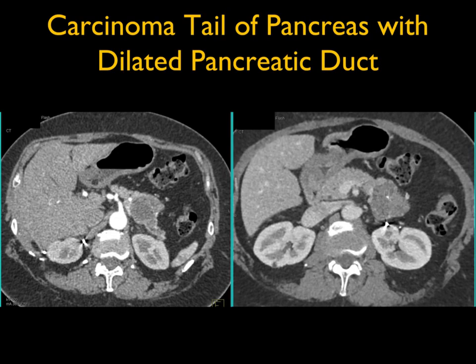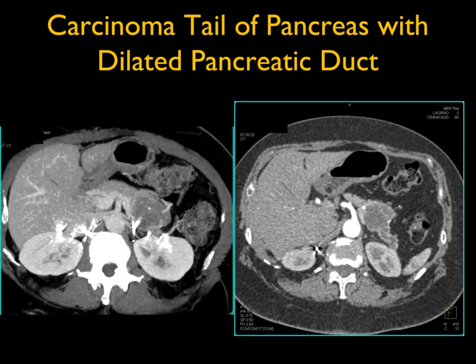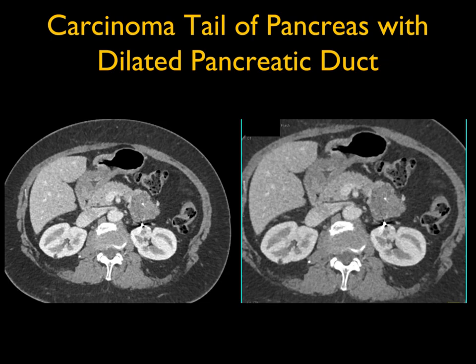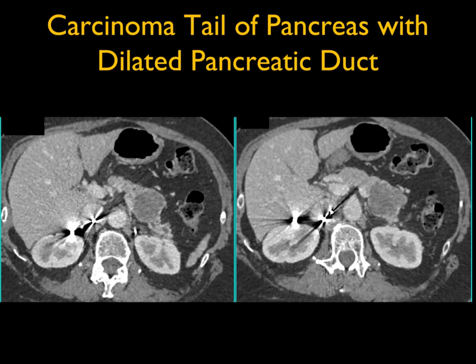Case six: carcinoma of the tail of the pancreas with a dilated pancreatic duct. There's a cystic component to the lesion and a faint calcification. The first thing one might think is: could this be a serous cystadenoma of the pancreas? They often have a Swiss cheese appearance, better seen on venous than arterial phase imaging, with punctate central calcifications. However, in this case, the dilated pancreatic duct and distal gland atrophy are helpful clues — it's rare to see duct dilatation with serous cystadenoma. This was actually an adenocarcinoma simulating a serous cystadenoma.